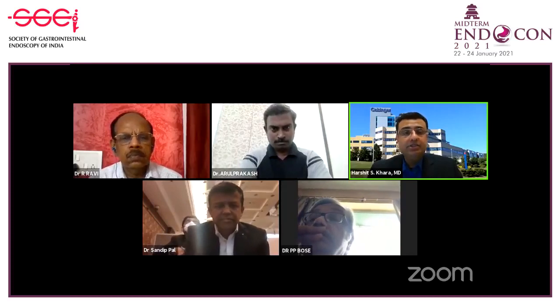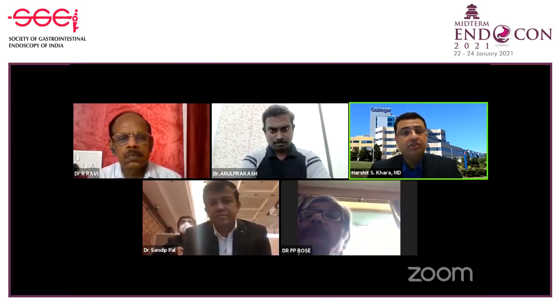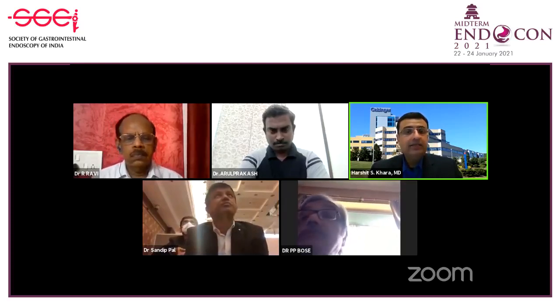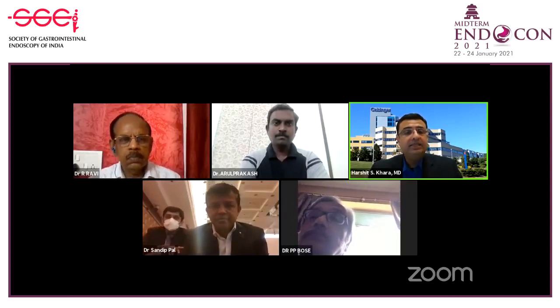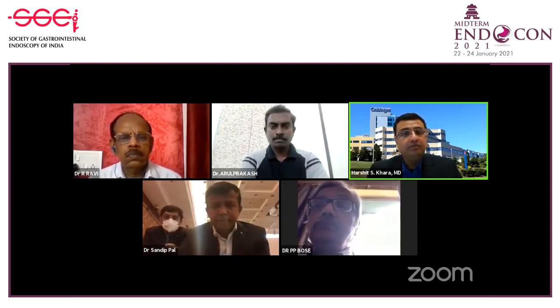In patients as a bridge to surgery, they have not had problems with the laparoscopic work that they do. Like I said, there is usually a very nicely matured fistula, and the surgeons are able to do a laparoscopic closure. In some cases, I was able to offer them endoscopic closure at the same time by placing an over-the-scope clip internally, and then they're able to dissect on the outside. There was not a problem at all for the surgeons to remove it.